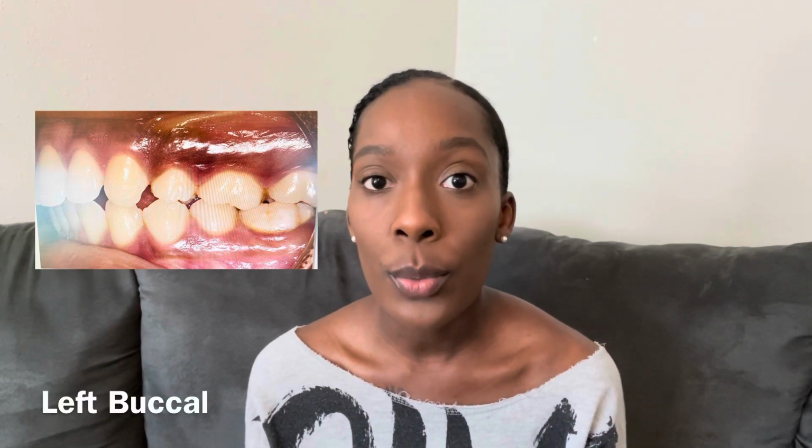The next intraoral is called the left buccal. The left buccal consists of the left side, and in this image, the orthodontist is looking for the bite and how the patient bites on the left side. Again, the orthodontist distinguishes different bites by using classes, and the orthodontist will see what type of class this patient has on the left side. Basically, just what kind of bite they have.